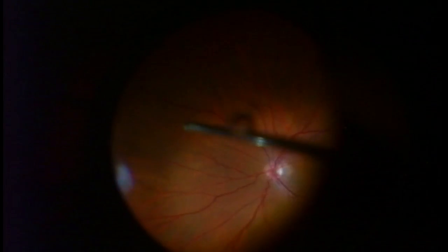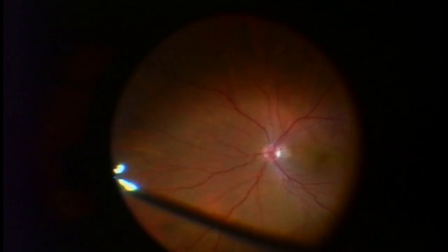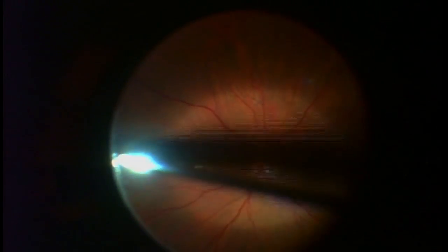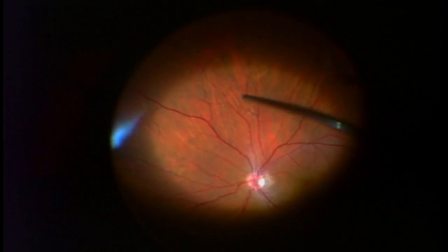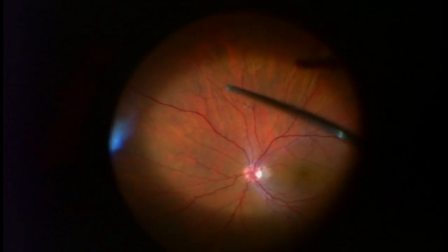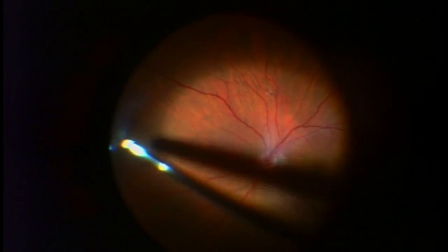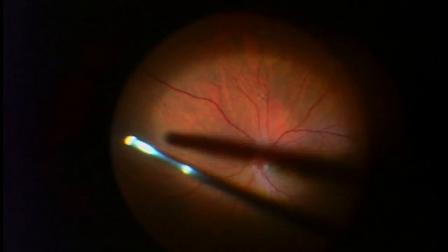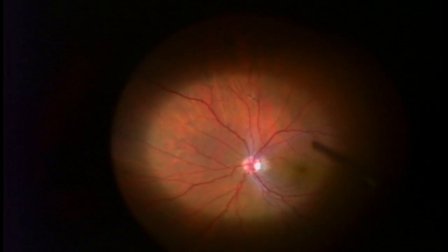The idea of operating in this scenario is to significantly reduce the number of floaters without causing permanent damage. So I always have to gauge how aggressive I need to be in removing the peripheral or side vitreous. Once I'm done, and it doesn't demonstrate it here, I'll look for holes or tears by depression. I'll actually depress from the outside in.